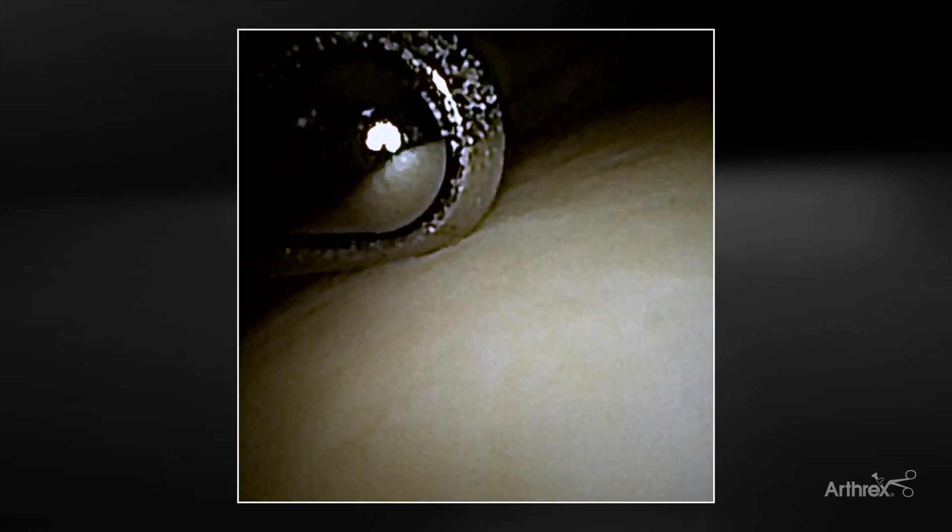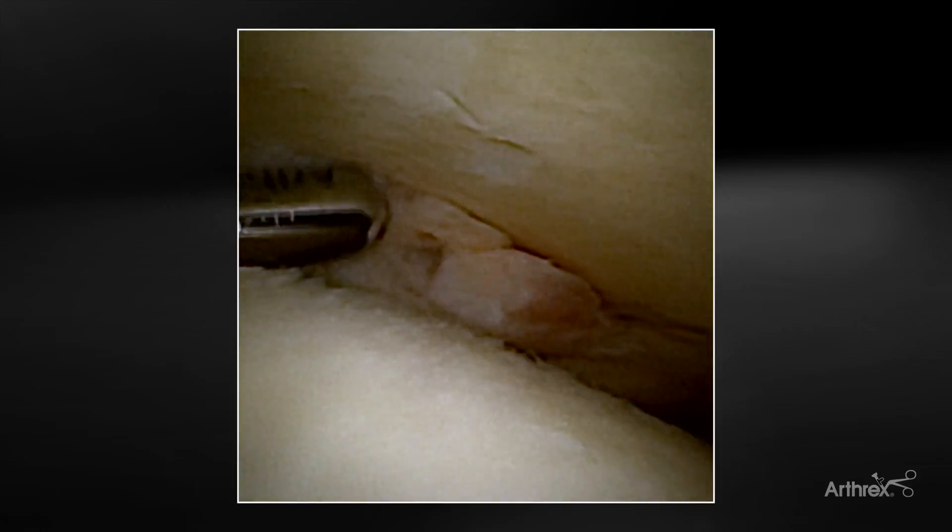I left all the synovitis when we first entered the joint so I could show you just how quickly and easily that works. I do love how smooth it is entering the joint without these teeth that will scar the cartilage — smaller, smoother, but still aggressive, and great suction. Coming back, you can see how we can work towards the back of the joint, clearing out any synovitis or herniation of the syndesmosis.